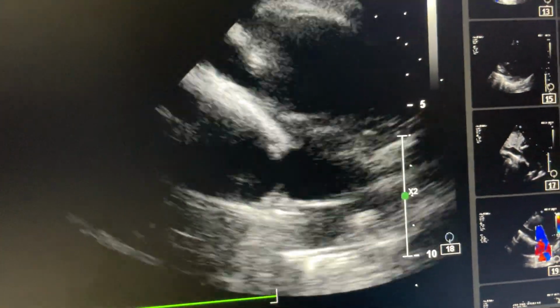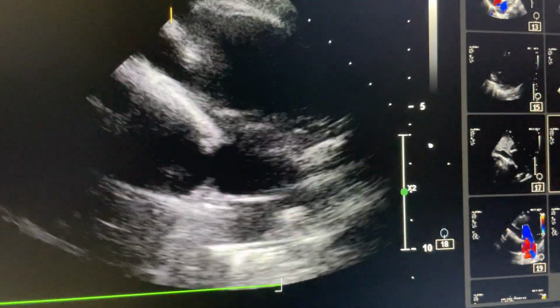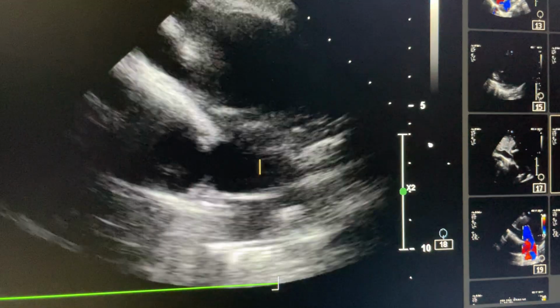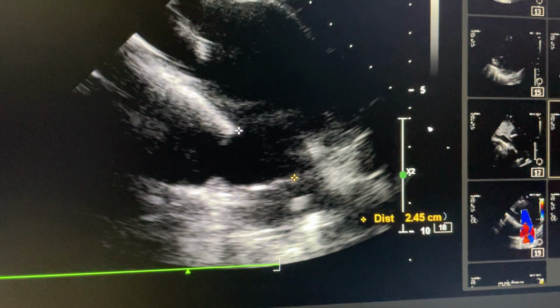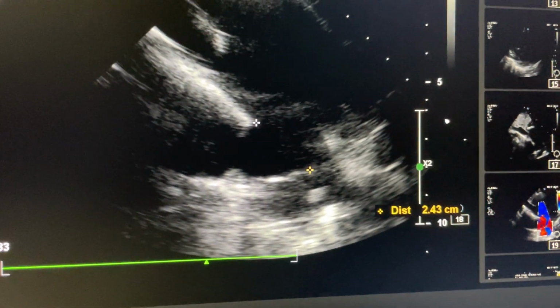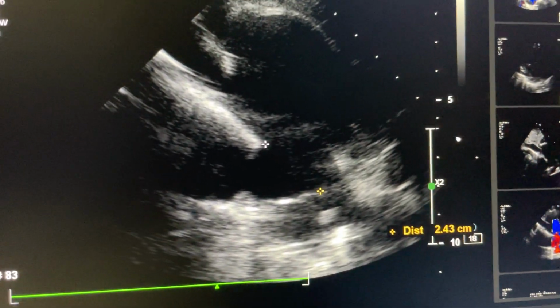Again, you see this is the portion where the large sinus venosus ASD is. Use the size. This would be the size of this patch, the minimum size of the patch, the minimum size of the sinus venosus ASD.